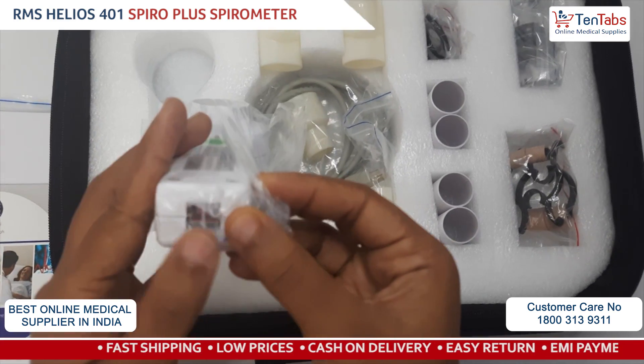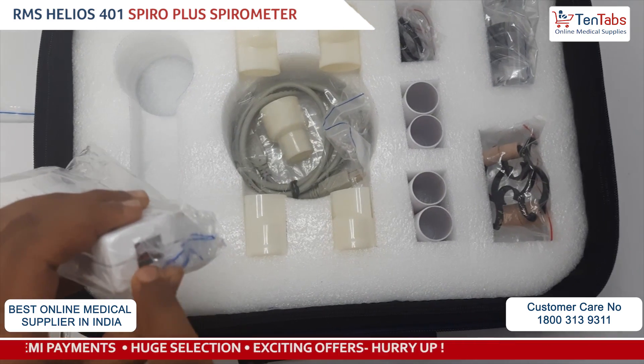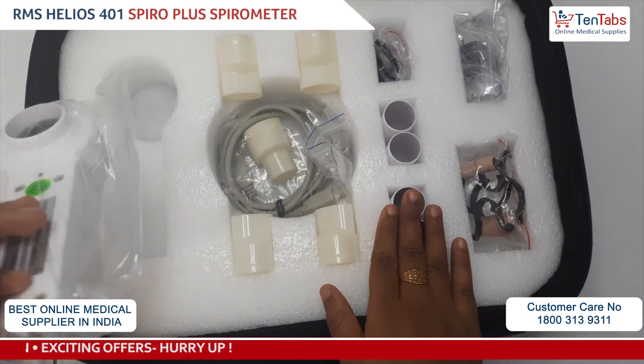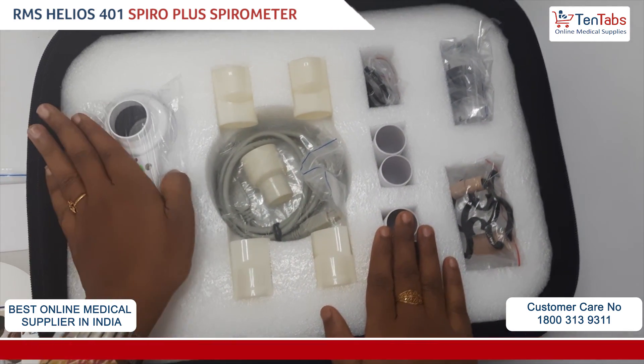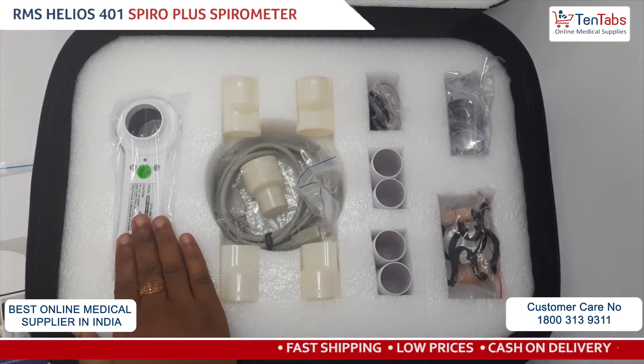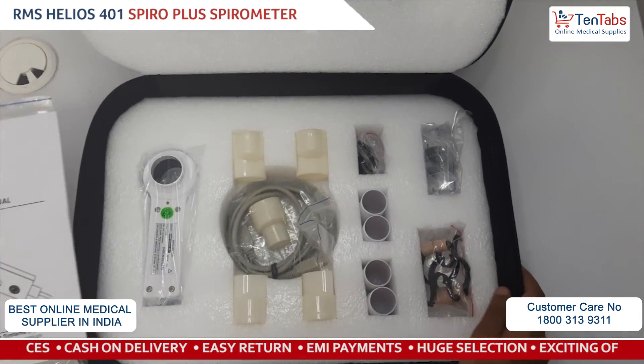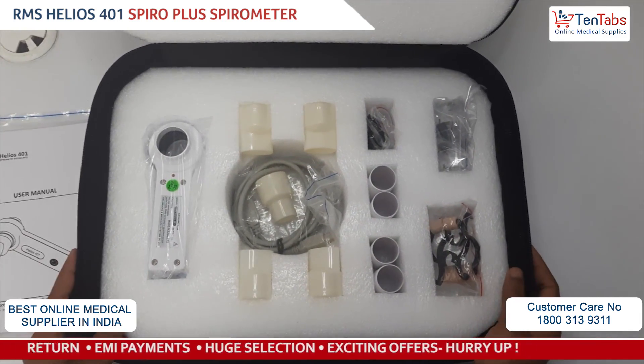After you install the software on your PC or laptop, there is a USB port on the device. When performing the test, connect the USB cable to your PC software and then perform the test. That's all for the unboxing video for the RMS Helios 401 spirometry system. Thank you.